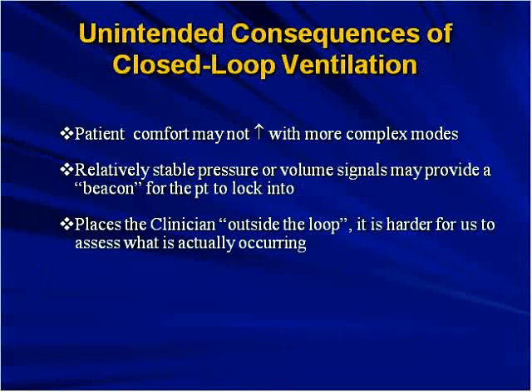Very good question. I'm sorry I kind of glossed over that. Just use the graphics on the ventilator. I think most of the ventilators we have out now, you do have a graphics package on the screen, and you can either just do it in real time, just kind of look at the peak flow rates, because they're formatted so you can actually kind of estimate the peak flow rate, or you can do a screen freeze and move the cursor. So one of the things we do is we'll just run like a full screen. We'll freeze it, and we'll put the patient back on assist control, then go back and scroll through and see what they're trying to do.